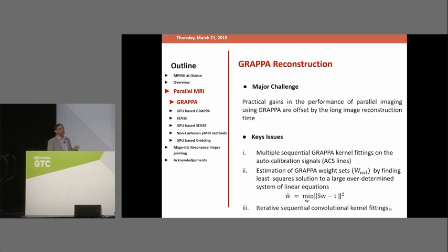So what are the major challenges? Because we wanted to use GRAPPA and parallel MRI to reduce the scan time.